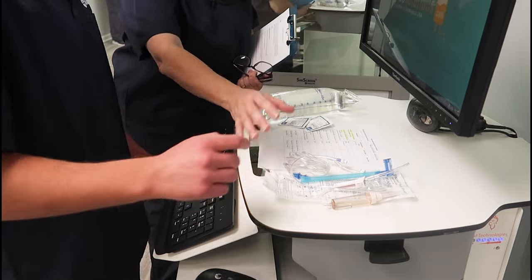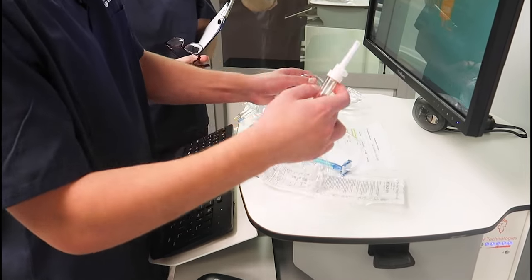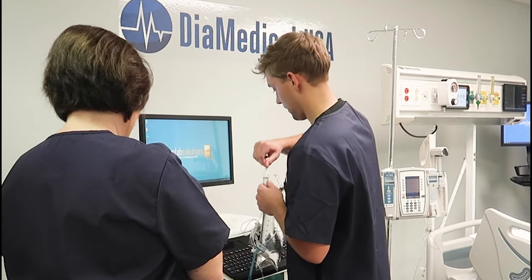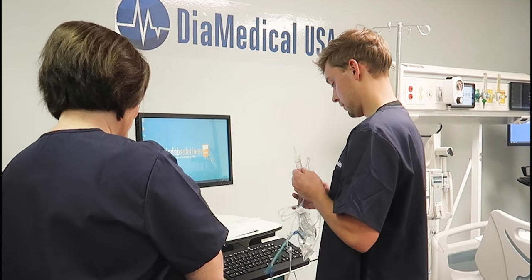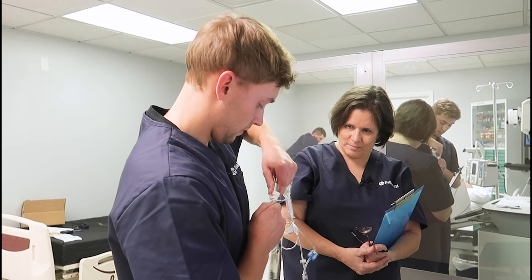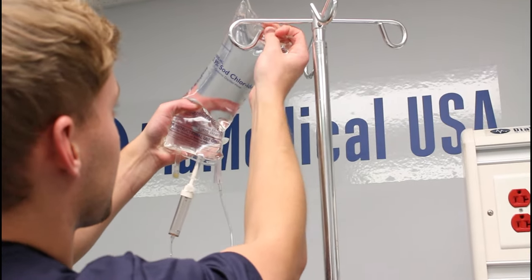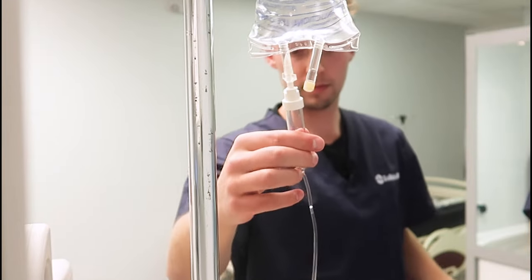So here's your primary tubing set, your MAR, here's your IV bag, and don't forget to close the roller clamp before you spike your IV bag. Now you can squeeze the drip chamber and prime your tubing.